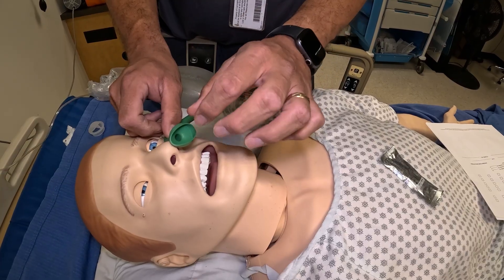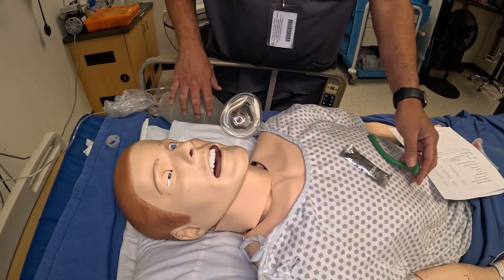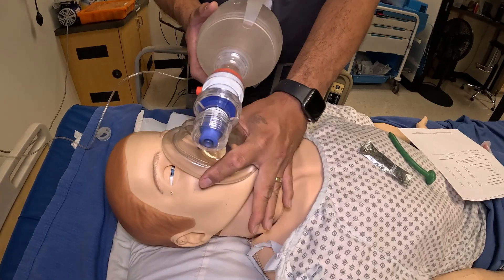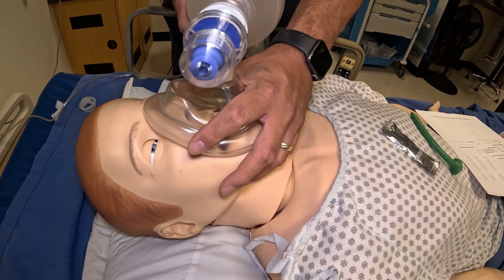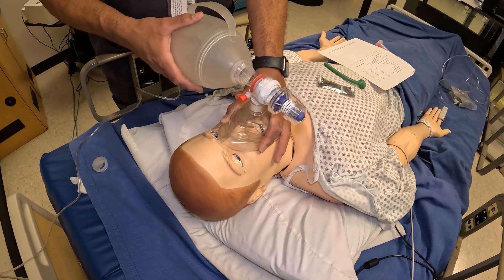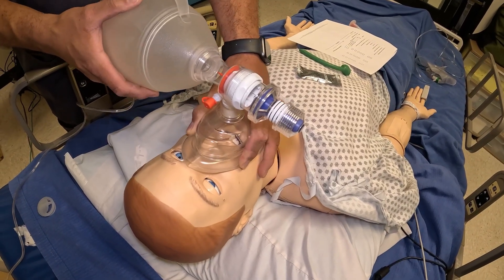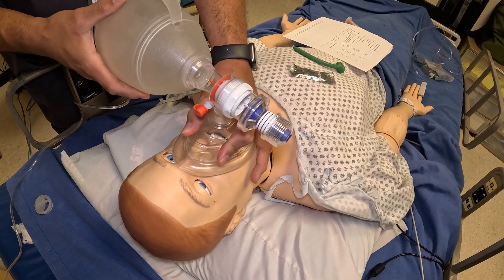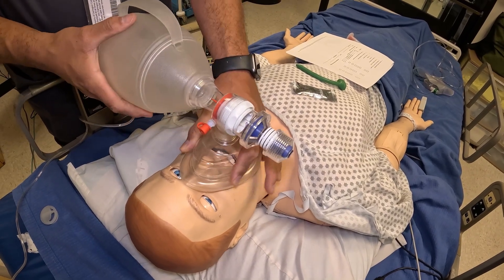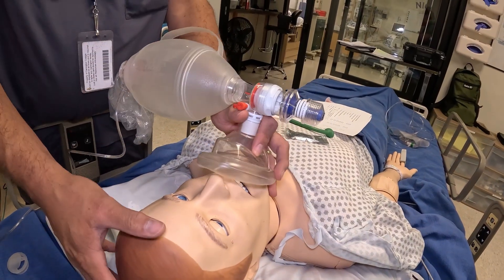With the NPA in place, you can suction down it without harming the nasal passages. Now we'll manually ventilate the patient. Use the E-C seal if it's just you; if you have a partner, use two hands to form a seal. Deliver one breath every six seconds: squeeze, one-one-thousand, two-one-thousand, three-one-thousand, four-one-thousand, five-one-thousand, six-one-thousand. Count in your head, not out loud. You want a good seal and visible chest rise and fall — if absent, readjust the seal or the patient's position.